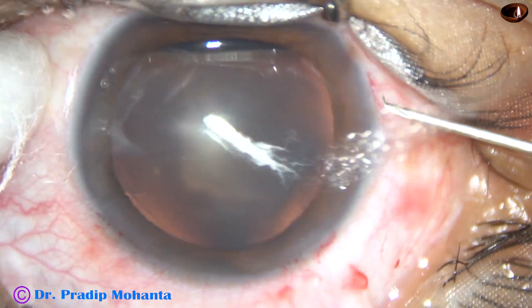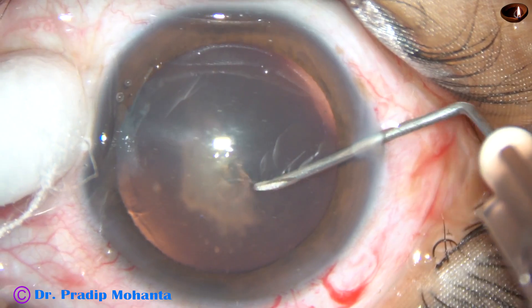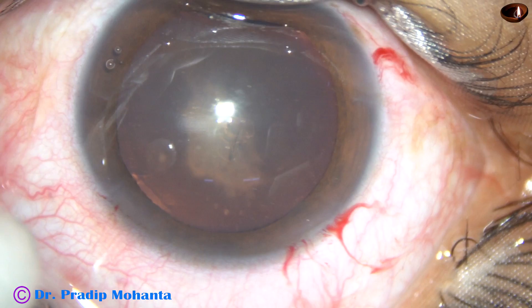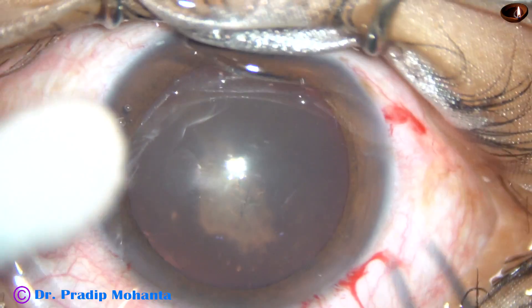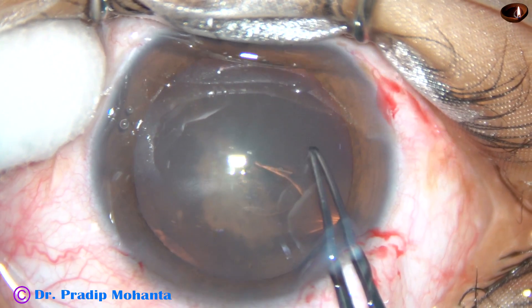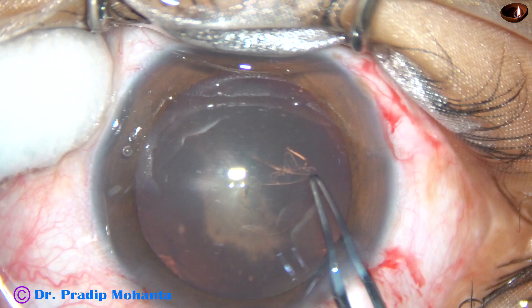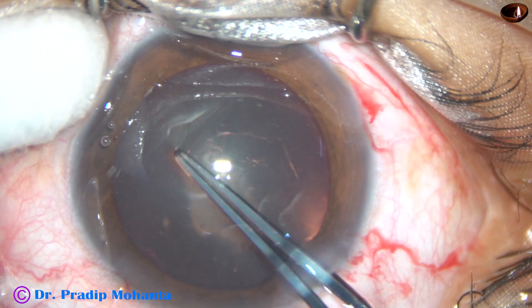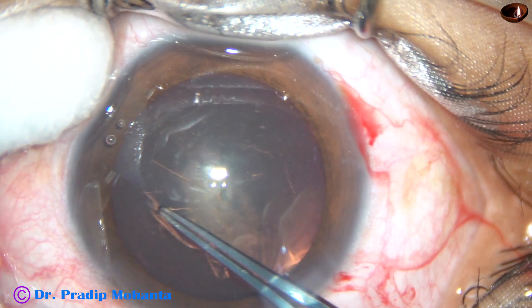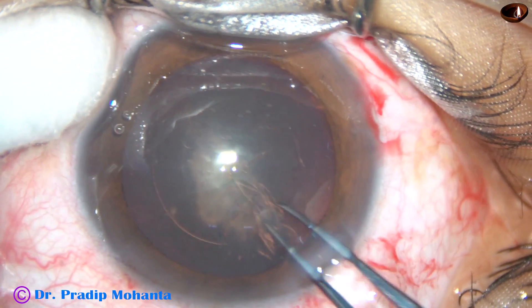I use a 26-gauge disposable bent needle to incise the lens and raise a flap. Then I use a capsulorhexis forceps, hold this capsular tag, and I usually go anti-clockwise and do the rhexis. Rhexis means to tear — you are just tearing off a portion of the anterior capsule.